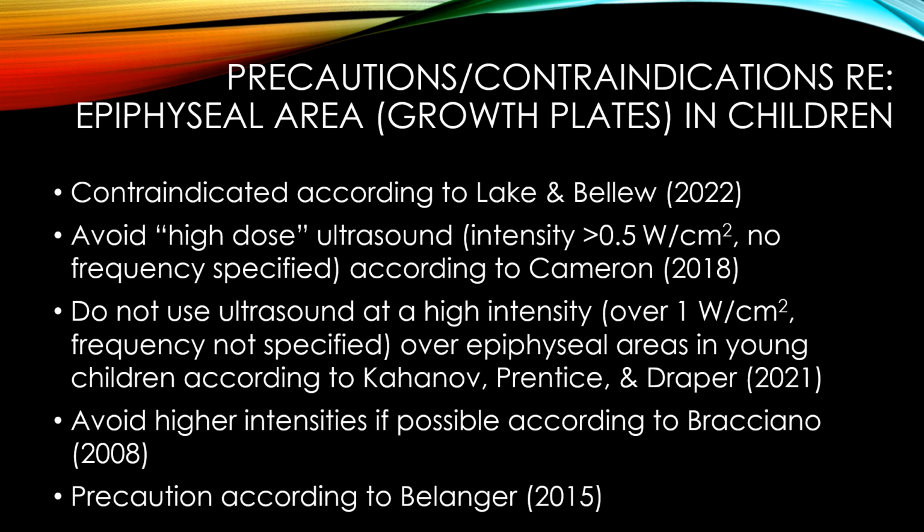Kahanoff, Prentice and Draper say do not use ultrasound at high intensity, and they define it as over 1 watt per square centimeter. Again, not specifying the frequency. Bracciano says avoid higher intensities if possible, and Bellinger just calls it a precaution. So you kind of have the whole spectrum here.